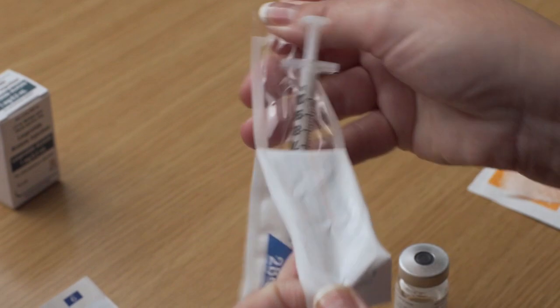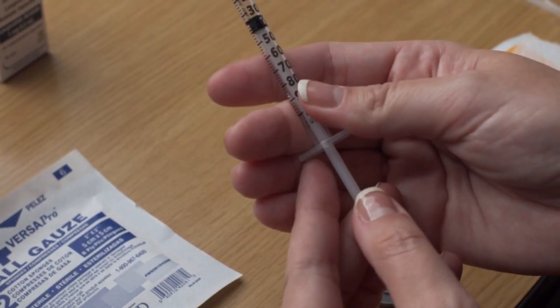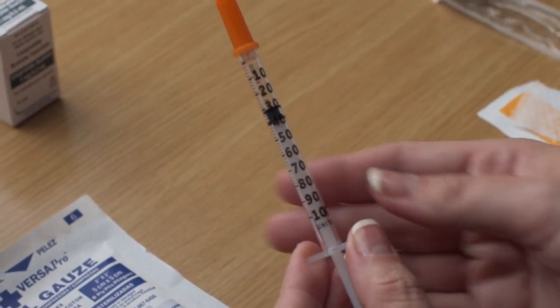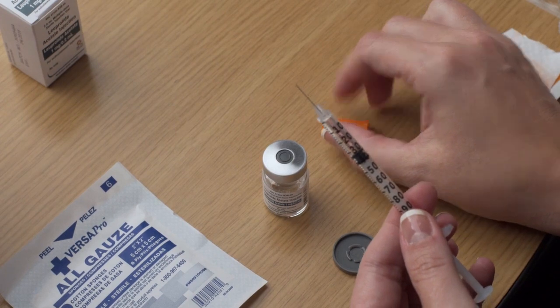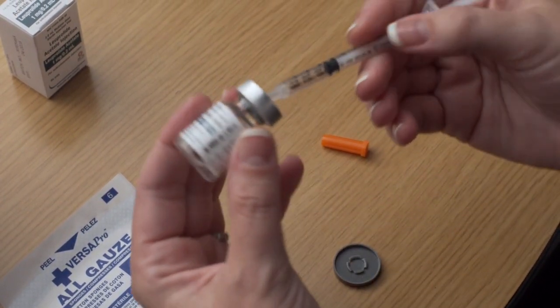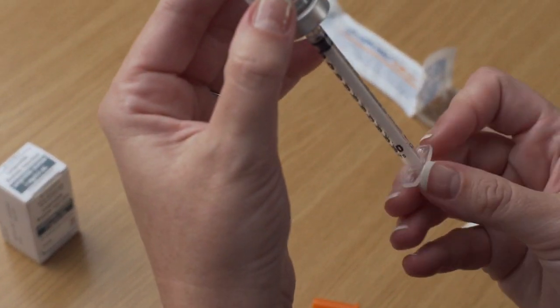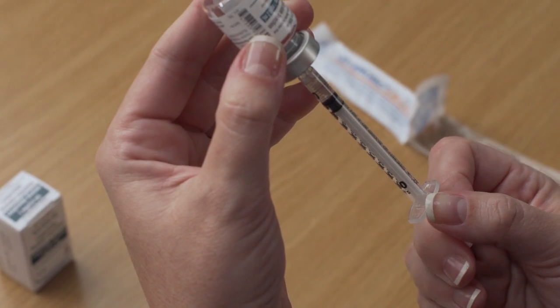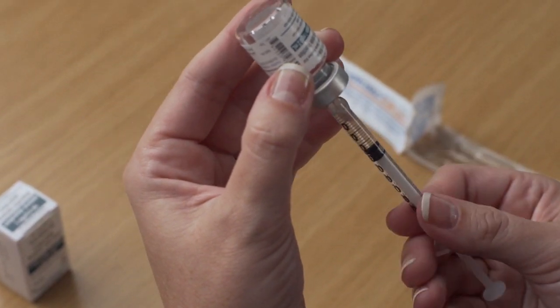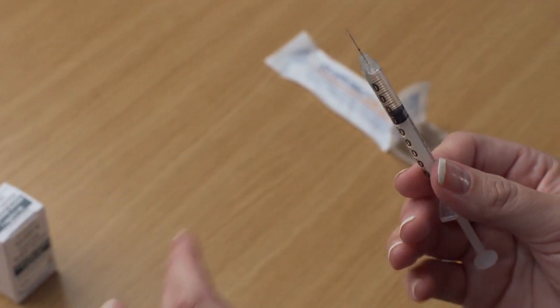Remove the wrapping from the syringe. To make it easier to draw from the vial, pull the plunger back to the number of units you were prescribed by your Aspire provider. Insert the needle through the marked center circle. Push the air slowly into the vial, then invert and draw the prescribed amount. Be sure the tip of the needle remains submerged in the Lupron and that you are not filling the syringe with air. Remove the syringe from the vial. You will not use the entire contents of the trigger vial.